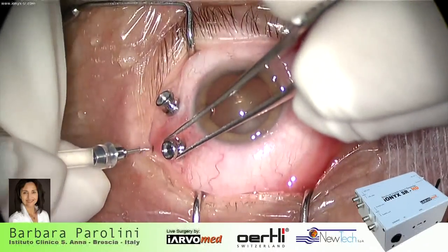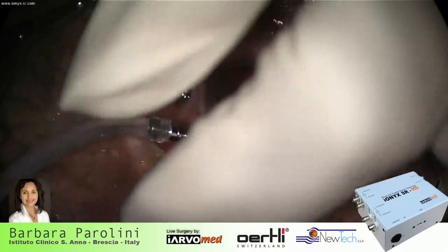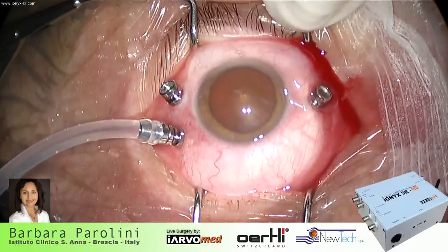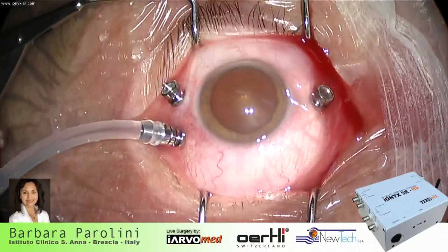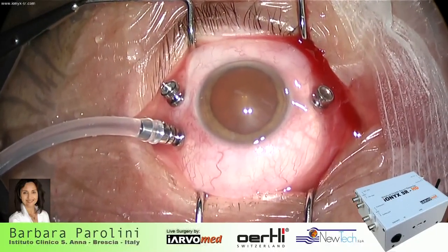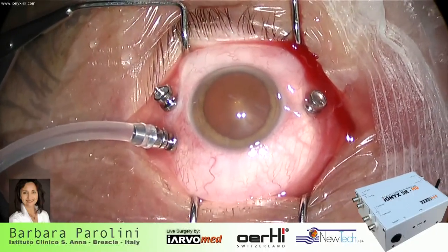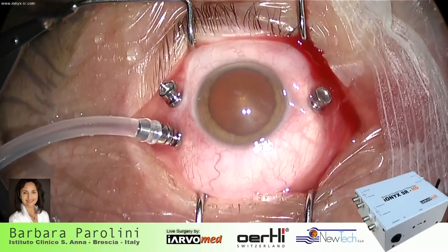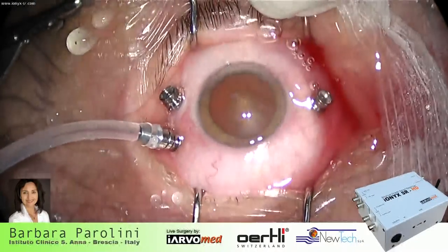So I will perform 23G vitrectomy in this case of central retinal artery occlusion. This patient has had the occlusion since a few weeks. She can see hand motion. We can observe some reperfusion at fluorescein angiography, as often.